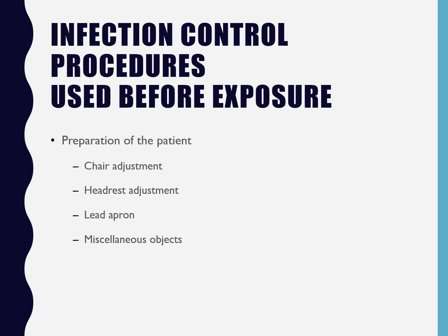Okay, so again, preparation of the patient: the chair adjustment, headrest adjustment, lead apron, miscellaneous objects. We want to have all of our ducks in a row before we bring our patient in. Chair adjustment isn't necessarily something that you might adjust before the patient sits down, because you don't know how tall that person is until they sit in that chair.